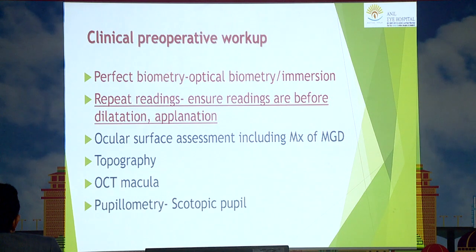Most importantly, I would feel is we do a perfect biometry, and what is important is we also repeat these readings every time for all these premium IOL patients. Ensure that these readings are done even before they are dilated, before an applanation tonometry, because you need a very good ocular surface.